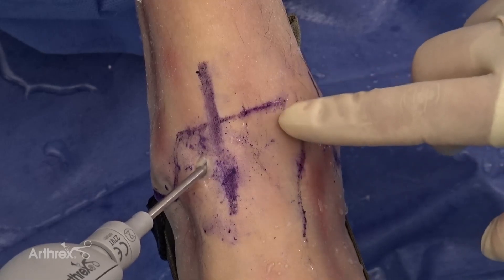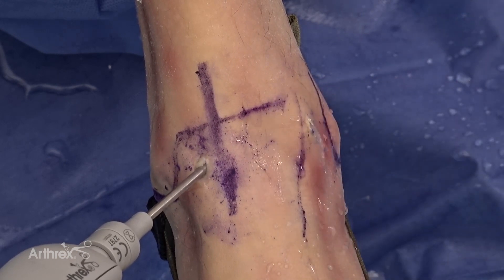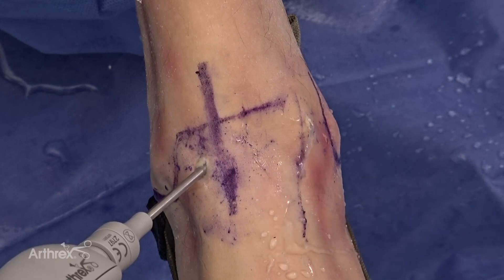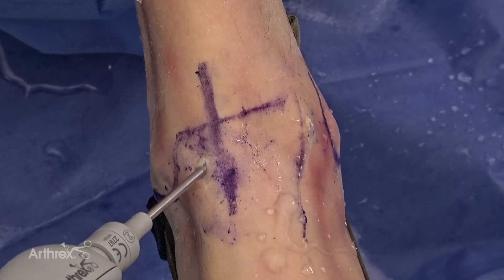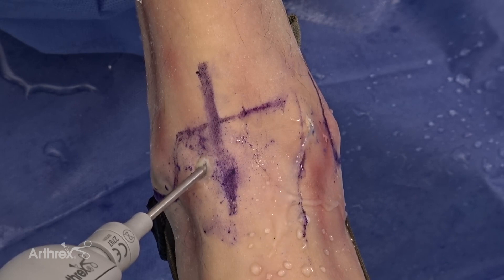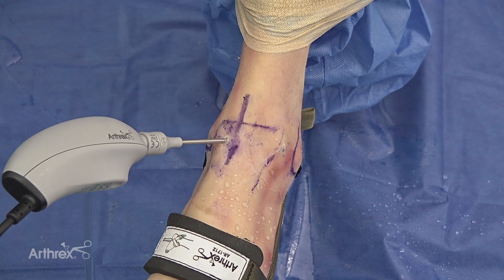Once you've harvested the osteochondral defect debris from the talus, go to your back table and mix the graft net harvested osteochondral autograft with your biocartilage — the extracellular matrix — and then mix that with concentrated platelet-rich plasma from bone marrow aspirate or platelet-rich plasma. In this setting you have the cell, the signal, and the scaffold, allowing you to create a beautiful AutoCart repair and reconstruction.